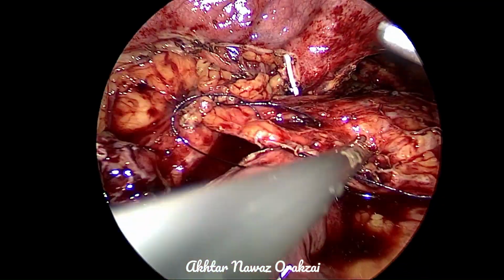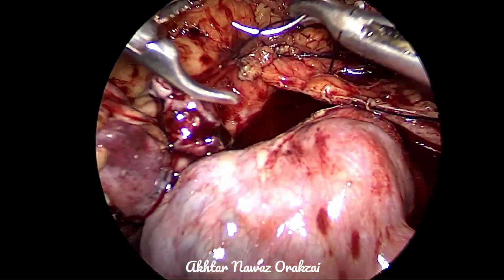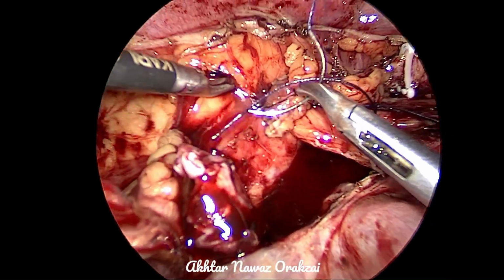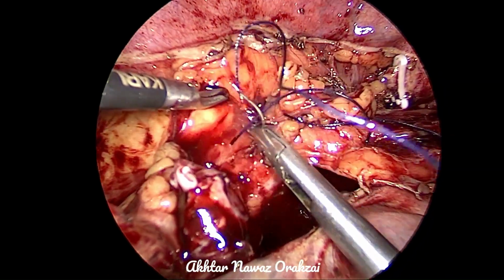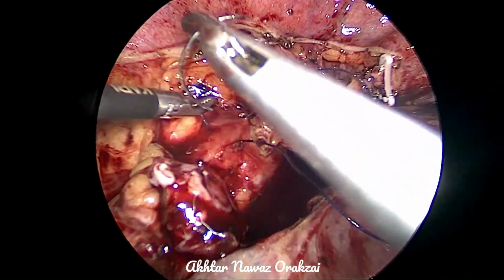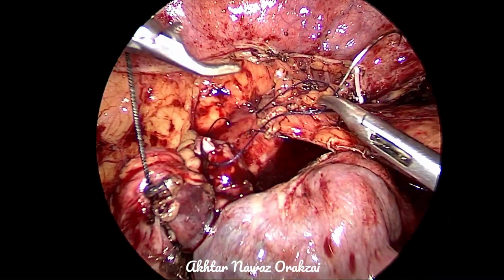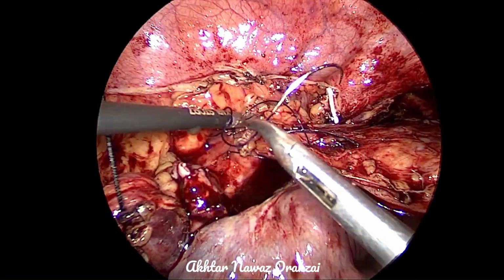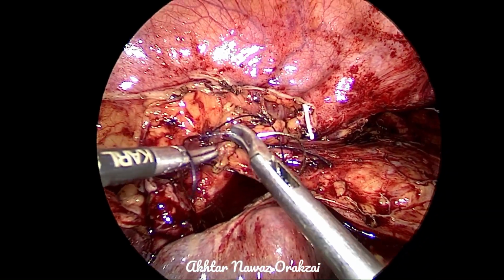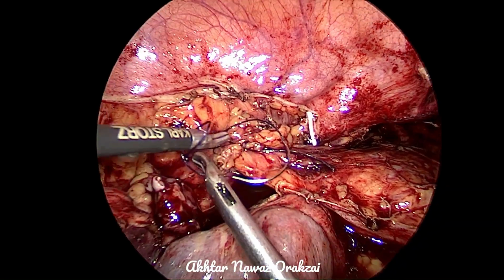Usually one suture is enough. However, for additional support to the single stitch, another stitch can be taken. Not really a deep stitch is required, only taking just the fascia or the epimysium of the muscle is enough.